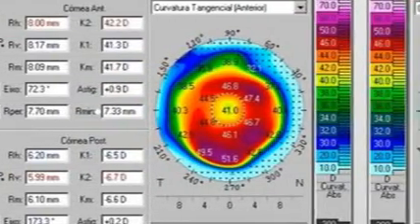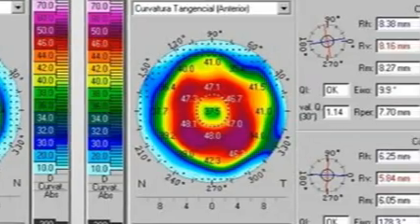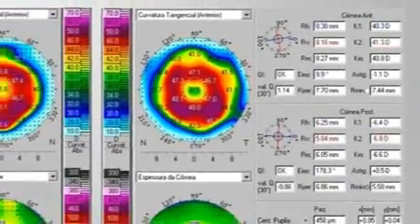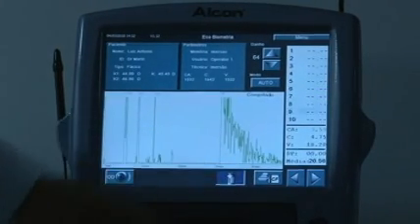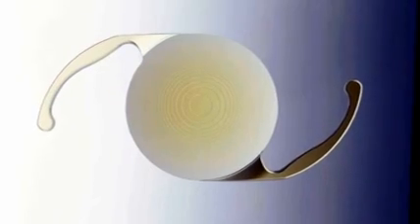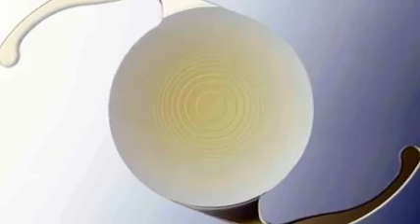Scheimpflug anterior segment topographic study (PENTACAM, Oculus) was used to calculate central corneal power. Keratometric readings of 41 and 37.5 diopters were found for the right eye and for the left eye respectively. The eye's axial length was measured by immersion biometry, OcuScan, Alcon, and IOL power was calculated using the SRK/T biometric formula. Routine phacoemulsification and bifocal ReSTOR SN6AD3 intraocular lens implantation was planned for both eyes.